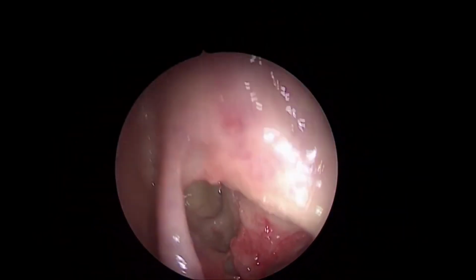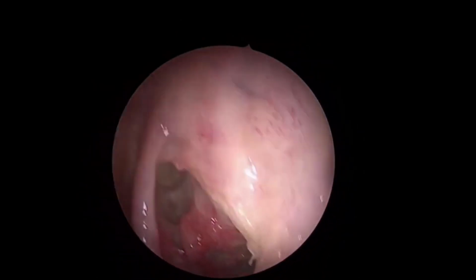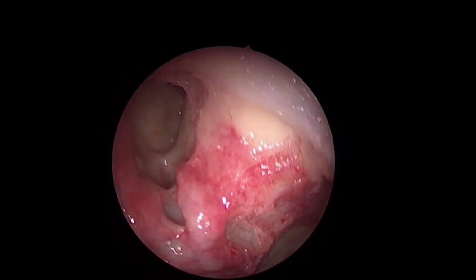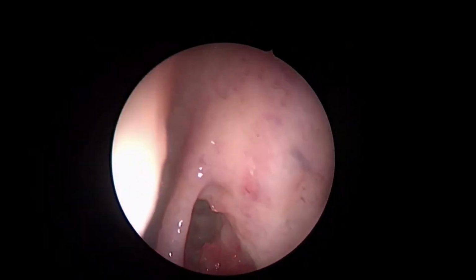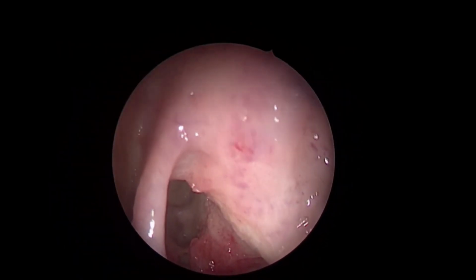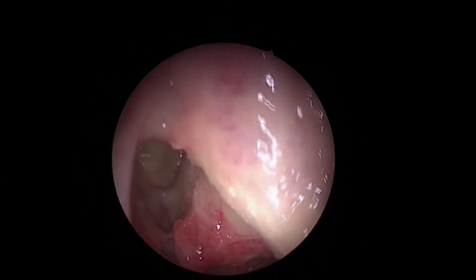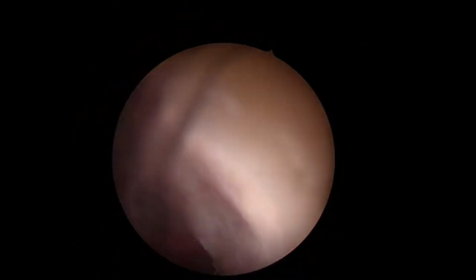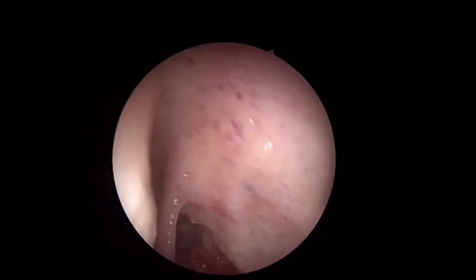the axillary flap approach, right angle, as propagated by Professor Wormold, which I believe was initially probably two decades back, when the 70 was not in use. So his concept was to remove the part of the axillary bone to facilitate entry into the frontal even with a 30 degree. He is so perfect in doing that, that he still does it without giving any complication.